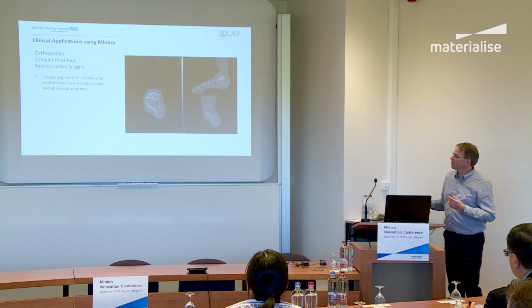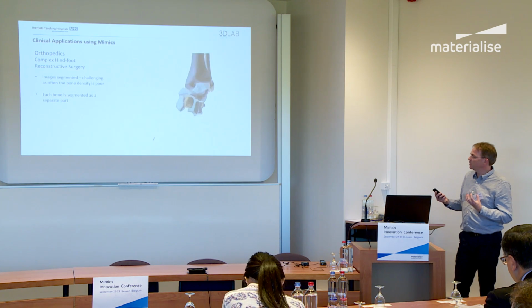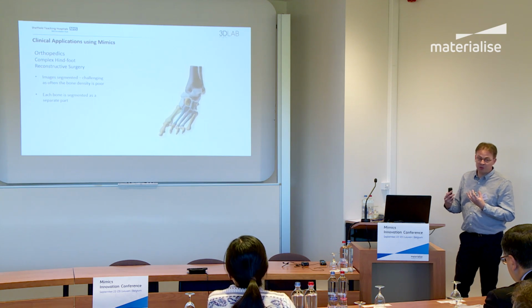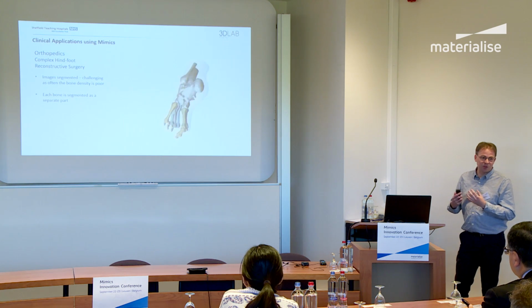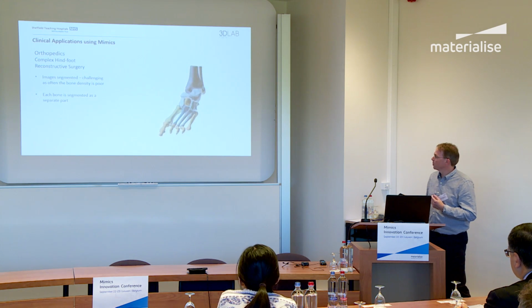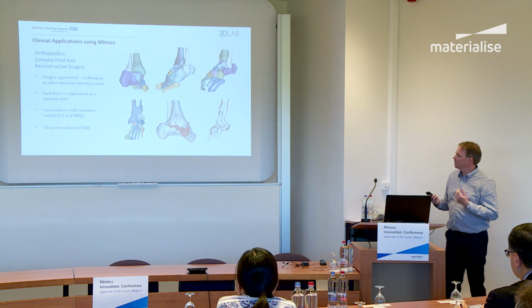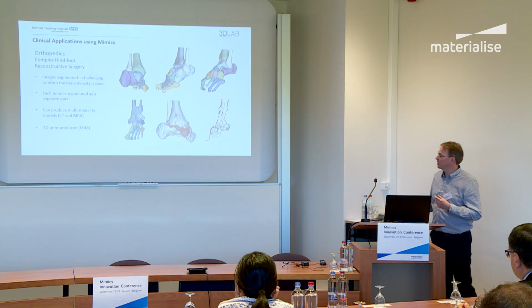And just lastly, complex hindfoot reconstructive surgery. We've done segmentation, and we're segmenting each individual bone separately, so that the surgeon can individually remove bones and get a good understanding of the anatomy of each bone and the relationships between each of them. And there's an example of some of the models that we produce, and we've also combined MRA data with the CT, so we can get an idea of the vasculature.